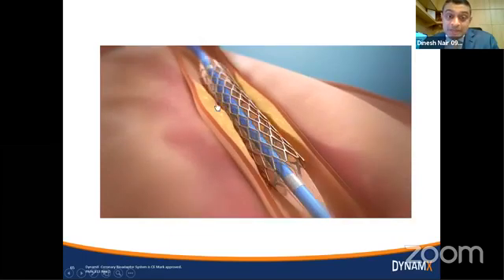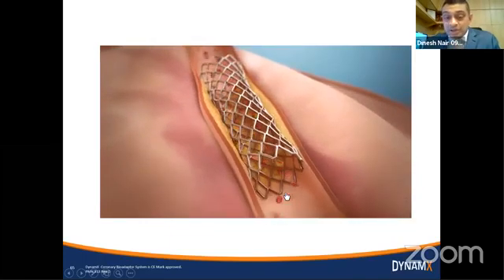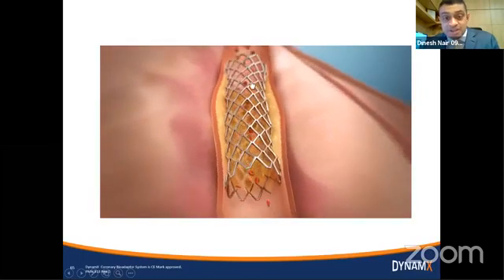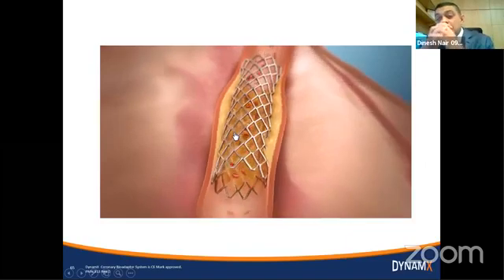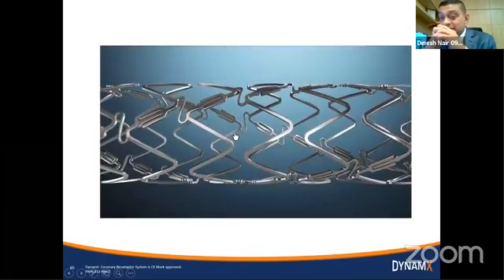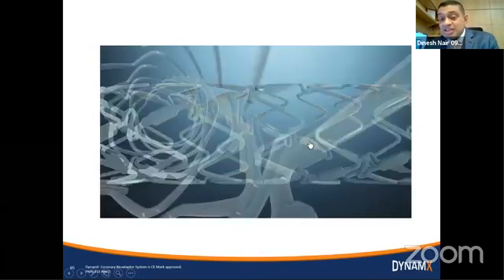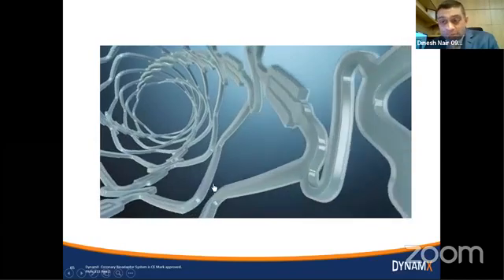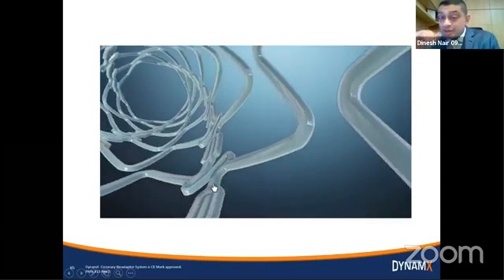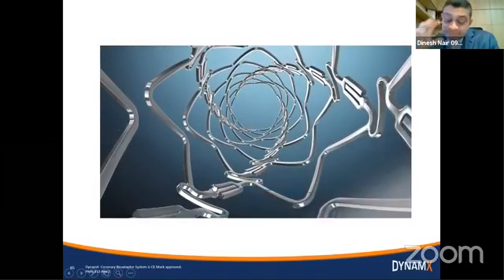This is what a block is like, and when it's stented, what happens to the artery. If you look at this segment here, you'll find that this is pulsating, and above there is pulsating, but this whole area is caged and unable to move. That is not the way nature intended things to be. So what happens with this is you have these hinges here, where there's a polymer sat on top. The bioresorbable stents used a similar sort of polymer, and this company actually has its own bioresorbable stents as well.